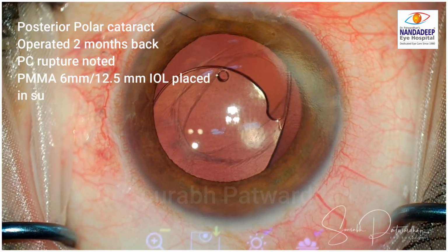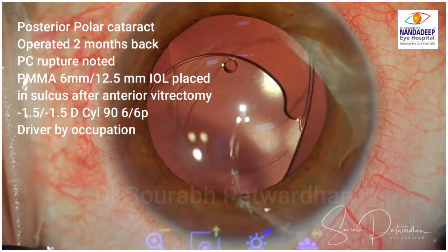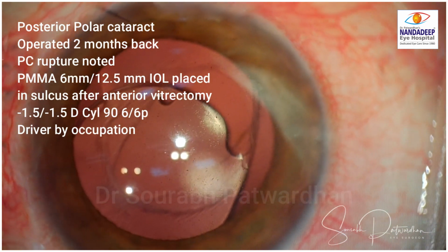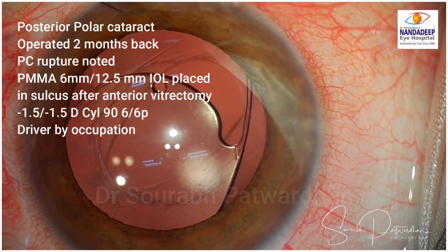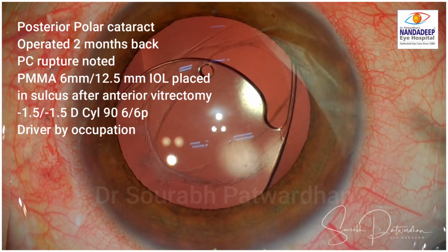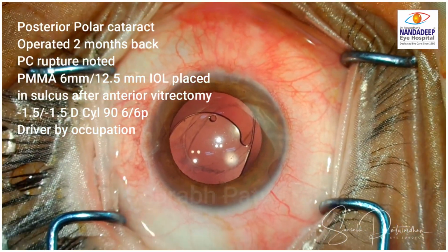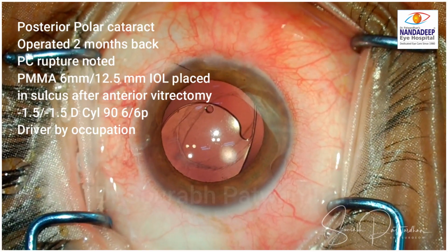Now this is a case where the patient had posterior polar cataract. I have operated the patient's other eye, and this eye was operated elsewhere, and the surgeon noted PC rupture. So after anterior vitrectomy, a PMMA IOL of 6 mm optic and 12.5 mm overall diameter was placed in the sulcus, and this patient was suffering from some refractive error. You can see there is a cylinder as well as spherical error.